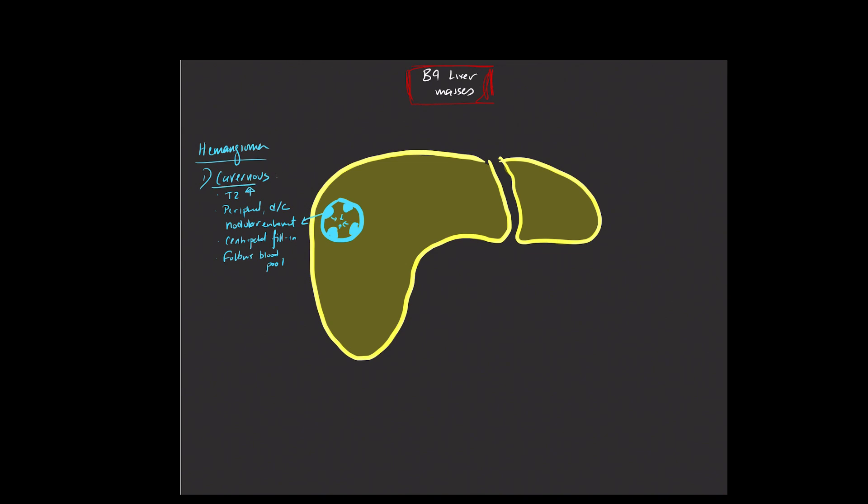Next up, we have what we call flash-filling hemangiomas. Sometimes these are also referred to as capillary hemangiomas. Like cavernous hemangiomas, these will also be T2 hyperintense. When you give contrast, they'll enhance on the arterial phase imaging.